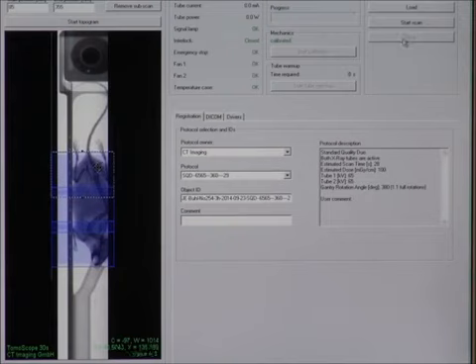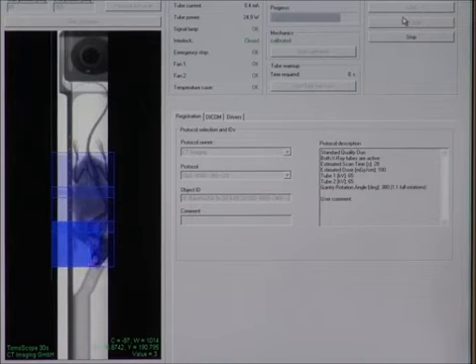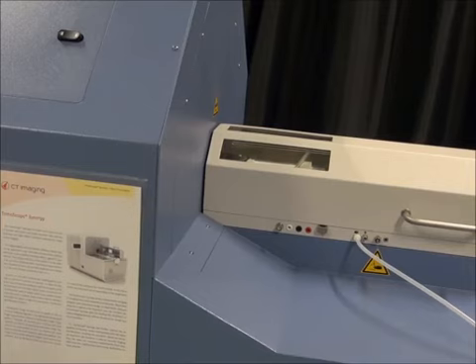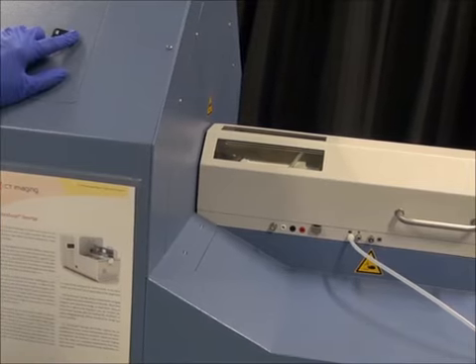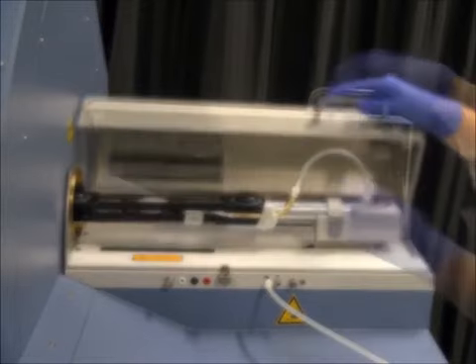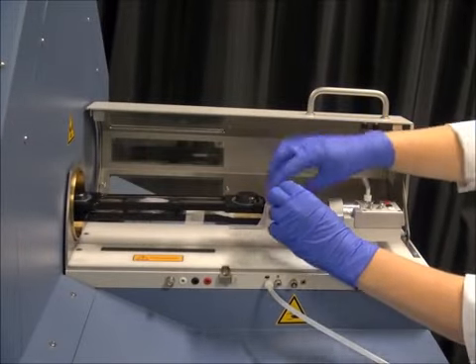After starting the scanning, the progress is shown with dark blue progress bars. Our flat panel µCT scans the subscans subsequently, which is different from a clinical spiral CT. Using the buttons, the mousebed is moved to the front again. The shielding lid is opened and the anesthetic tubes are switched.